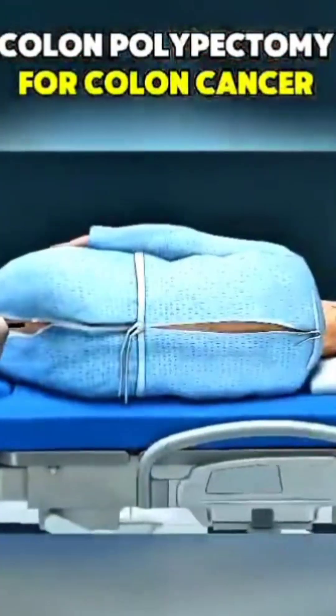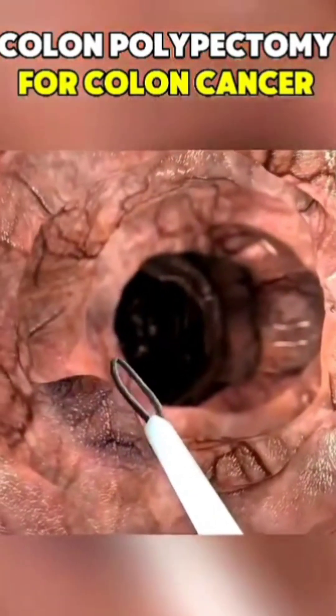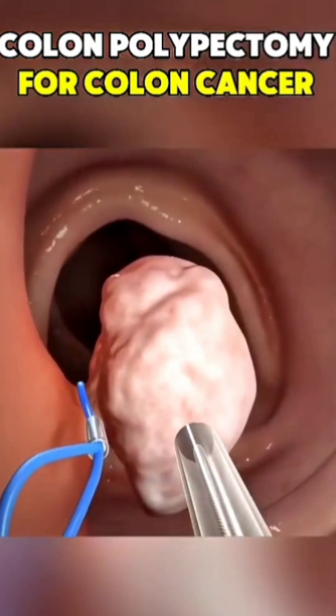Here's how it works. While you're lightly sedated, a flexible tube with a camera is passed into your colon. If a polyp is found, the doctor loops a tiny snare around it and cuts it off using heat or a wire. It's painless, bloodless, and often over in seconds.